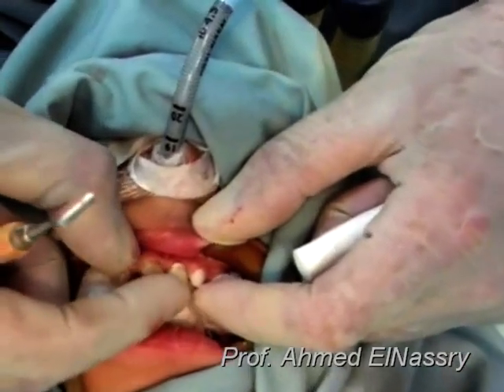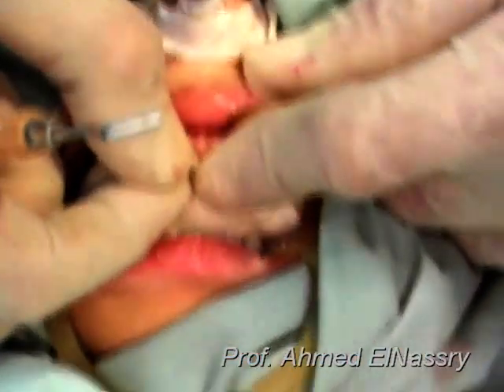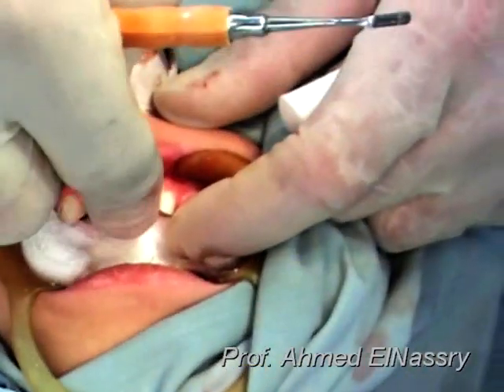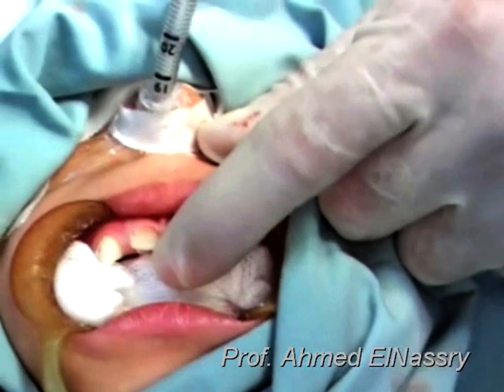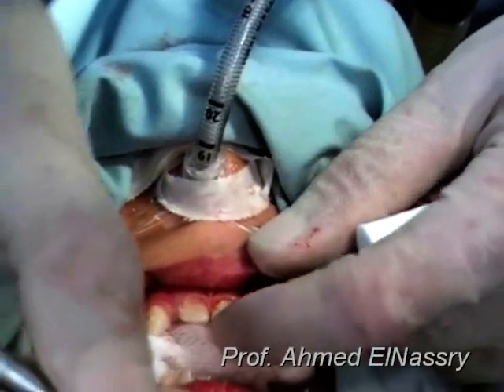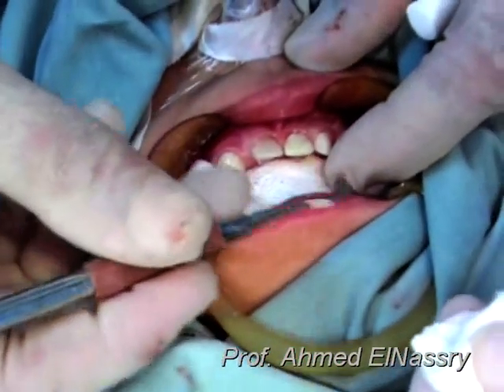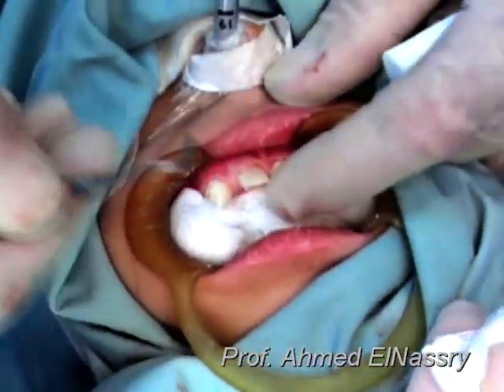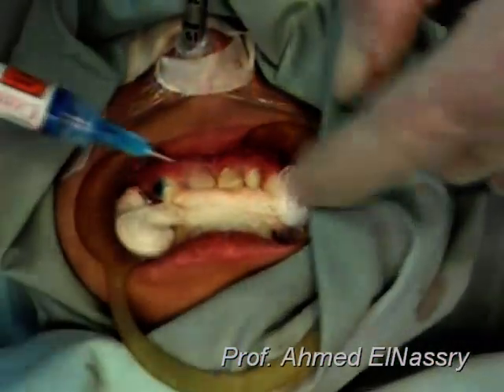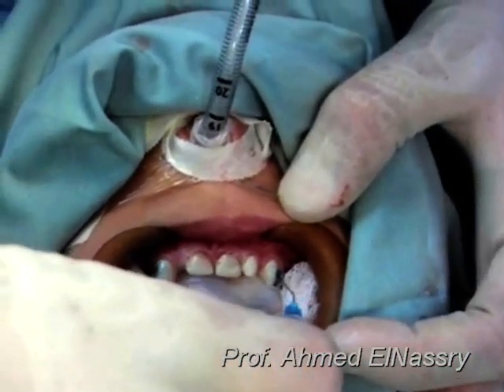And repeat the same procedure on the tooth 61: loading of the composite in the celluloid crown, insertion, and removal of the excess. And the curing, and start the composite filling in both canine.